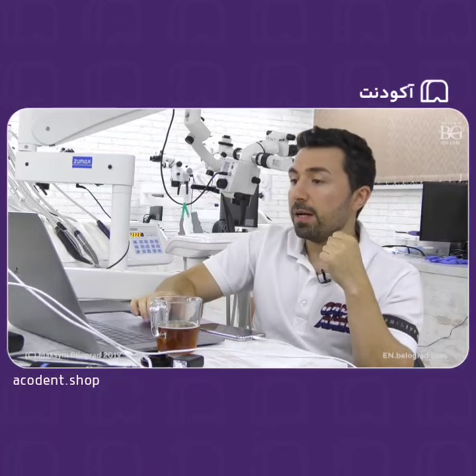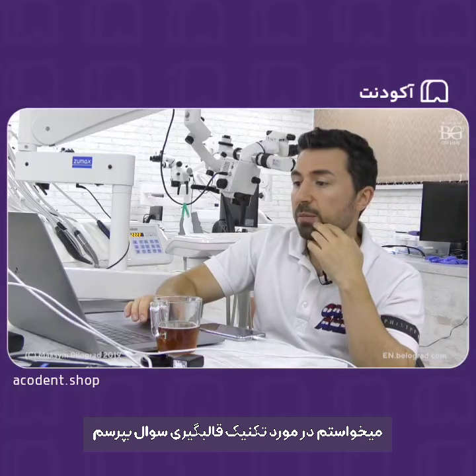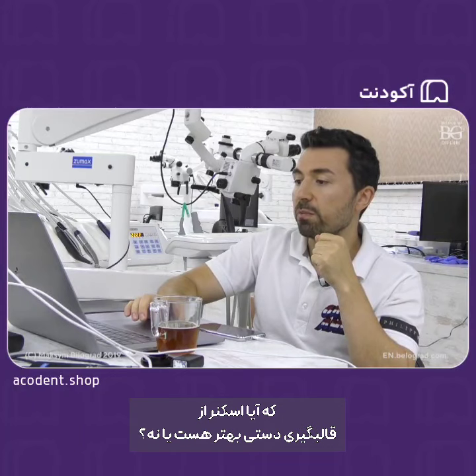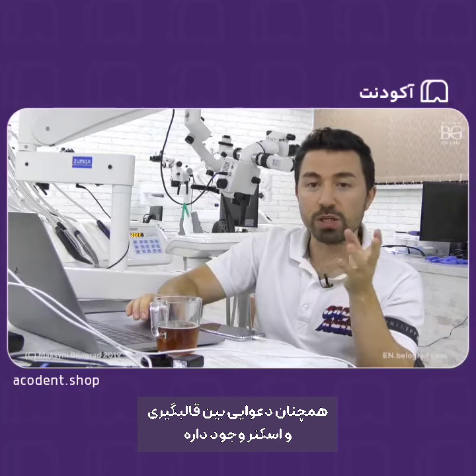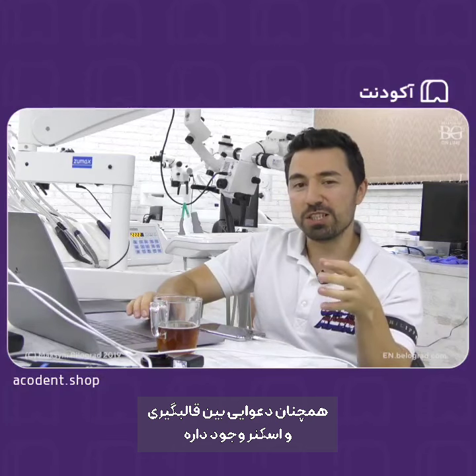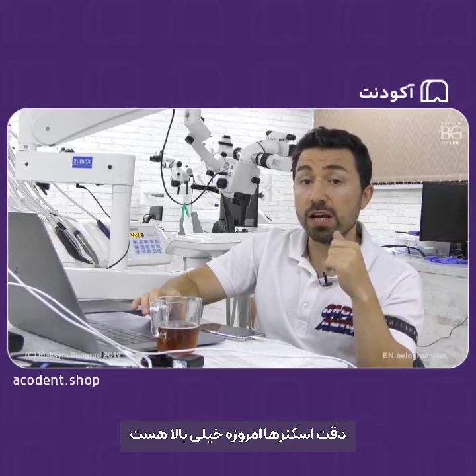You can. I would like to ask about impression. Balasim is asking a question: I would like to ask about impression technique, and is a 3D scanner better than impression? Still, there is a fight between intraoral scanning and impressions. The accuracy of intraoral scanners nowadays is really high.